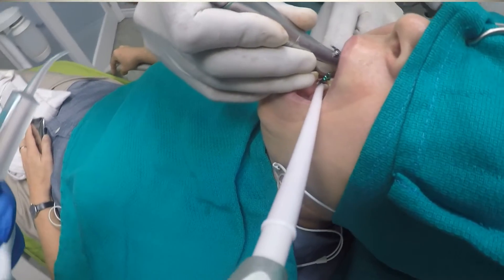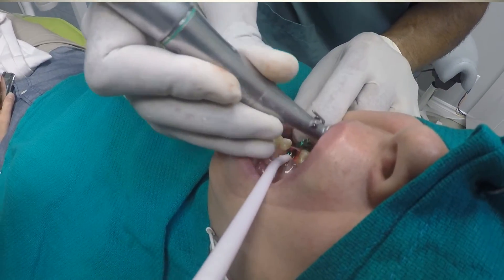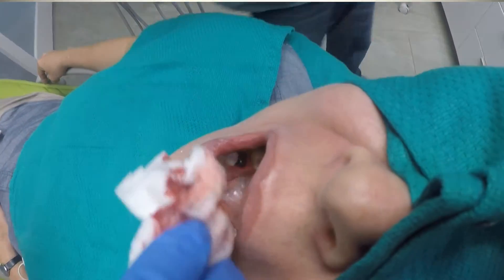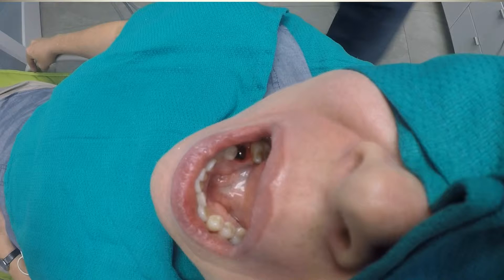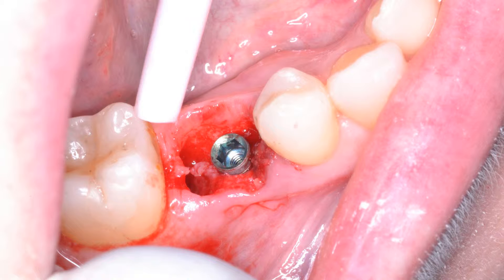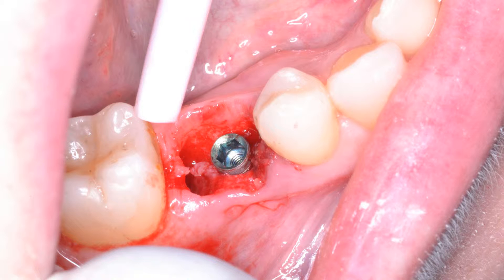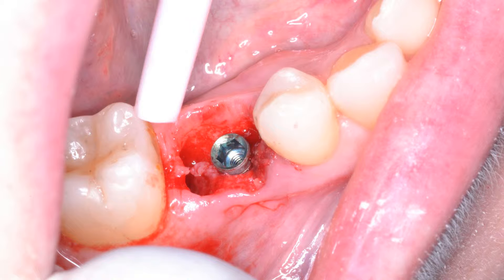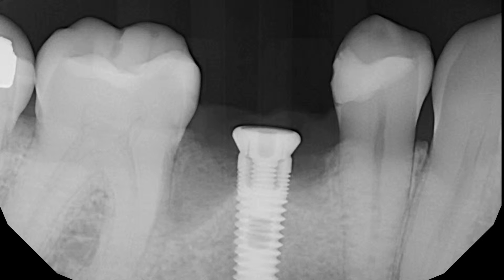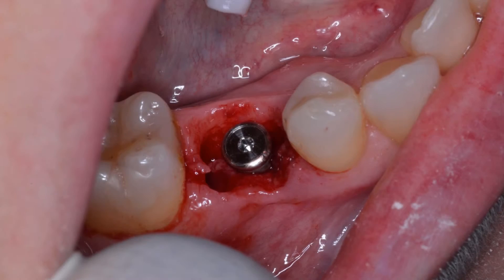This is on the actual motor. We've set the motor at 30 newton-centimeters torque, and it spins between 30 to 50 RPM. My assistant is placing suction so the patient's tongue doesn't contact the body of the implant. In this first photograph you can see the implant in position and appreciate the voids to the right and left created by the actual roots. The next radiograph demonstrates the final implant in place with a cover screw and healing collar.